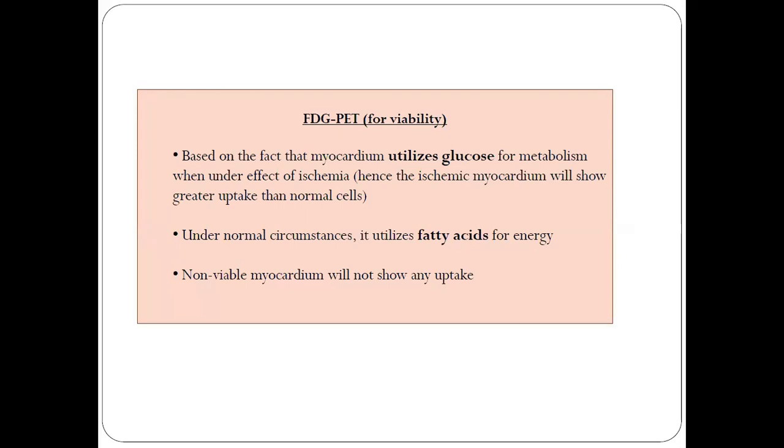Coming to PET scan, which is a positron emission tomography. So it is FDG PET for viability. It is based on the fact that myocardium utilizes glucose for metabolism under the effect of ischemia.